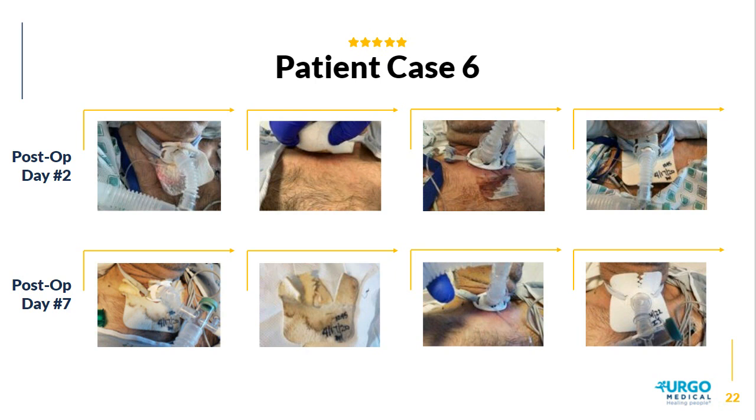And so we knew that it helped to maintain the immobilization sutures. The fourth picture shows that we cut a new dressing and we were able to secure that dressing underneath, accommodate the sutures, and have a very effective application of that dressing.